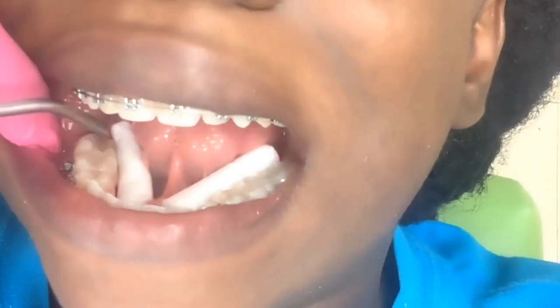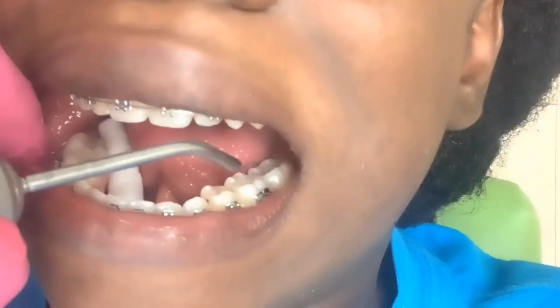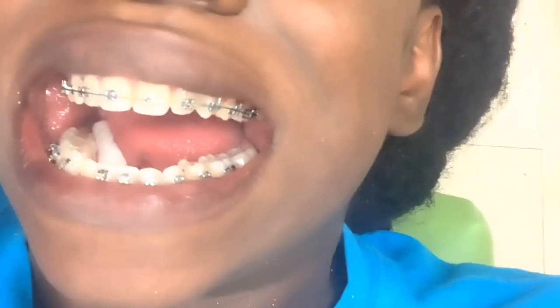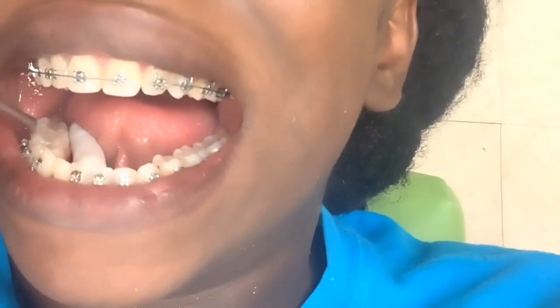So she's just drying off my teeth, drying it off, and she put those things on the side so that my saliva doesn't wet the teeth again. Okay, and then we're back. Yeah, so I had to cut certain parts out of this because I was pretty much just sitting there for a little while waiting. Okay, so she's putting the tongue crib back in.